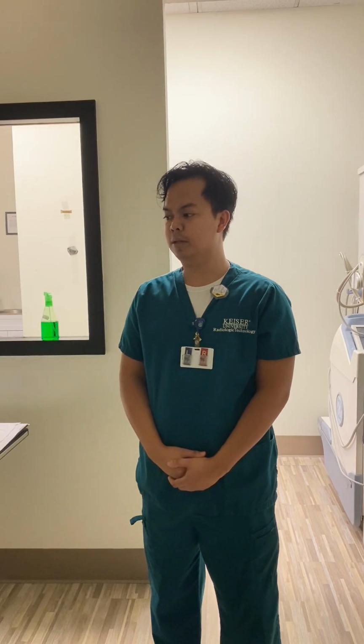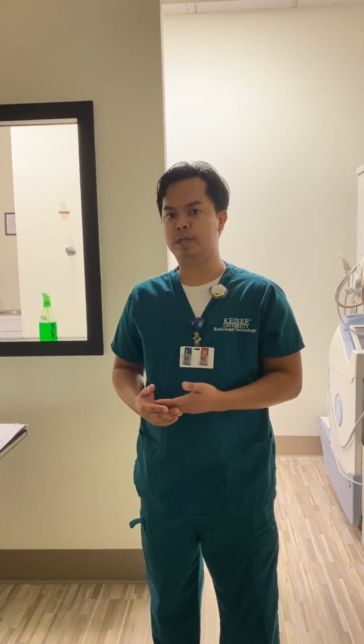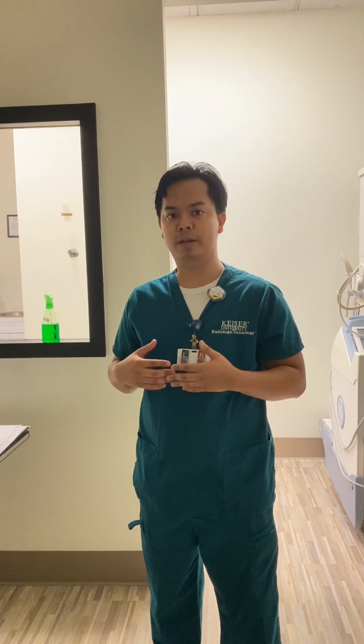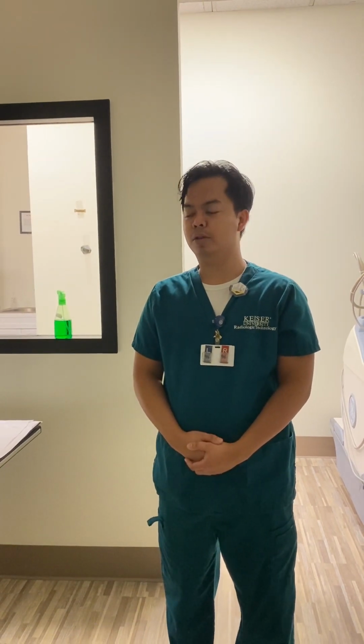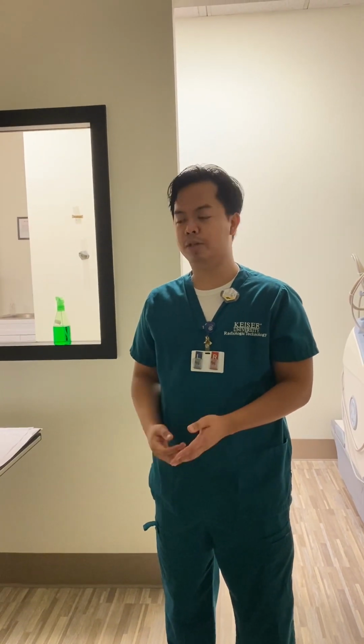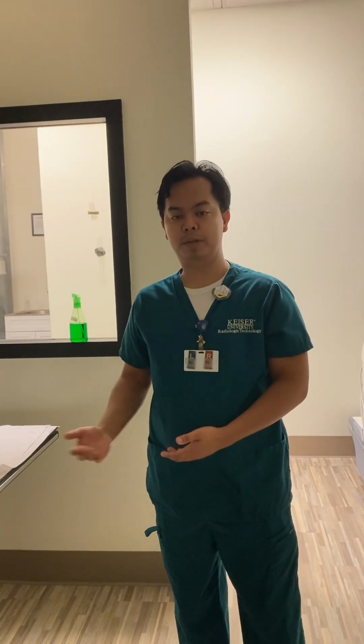So ask, is there any previous reason? Do you feel any pain, since we're doing the chest area, anything from the chest area, any pain at all? Use the scale from 0, because sometimes they don't have any pain, up to 10, 10 being the most amount of pain.